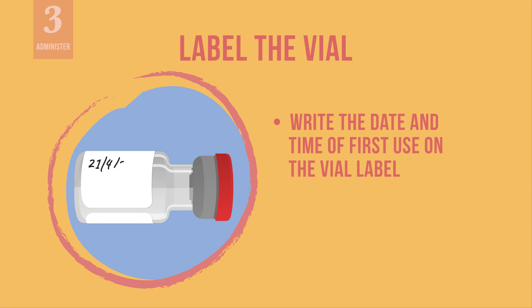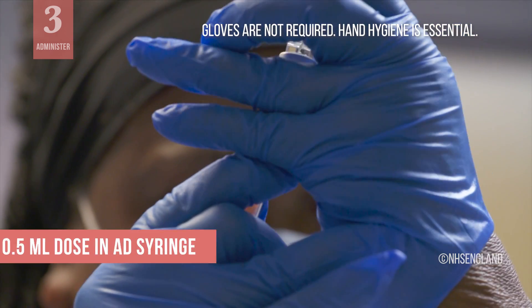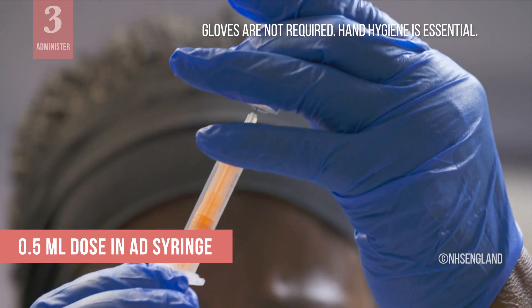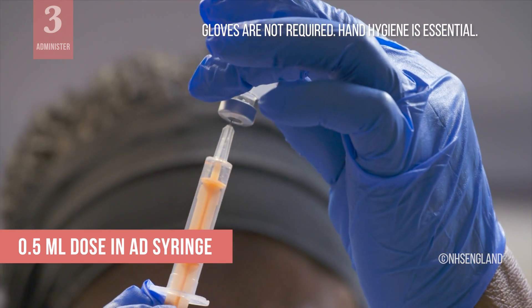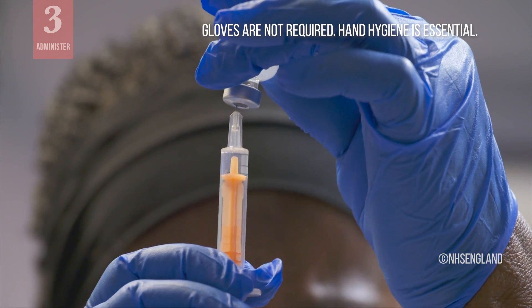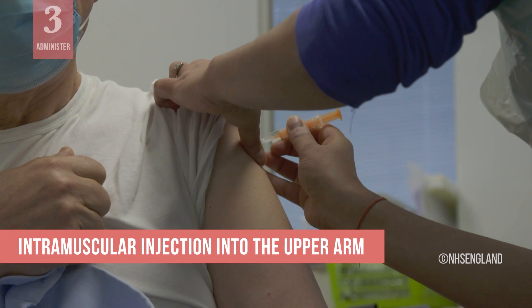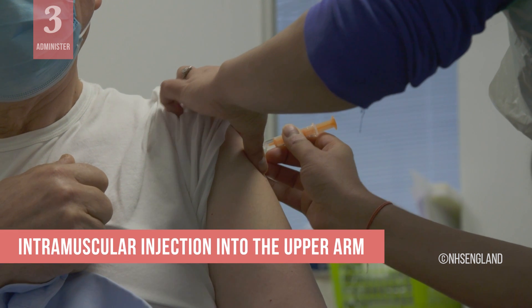On the vial label, write the date and time of first use. The first use is when you first puncture the vial and withdraw the first dose. Before withdrawing each dose, swirl the vaccine vial gently — remember not to shake the vial. Draw up a 0.5 milliliter dose into the AD syringe. Each vaccine vial contains 10 doses, so before withdrawing each subsequent dose, the vaccine vial should be gently swirled again. Administer the vaccine into the upper arm of the recipient using an intramuscular injection technique.